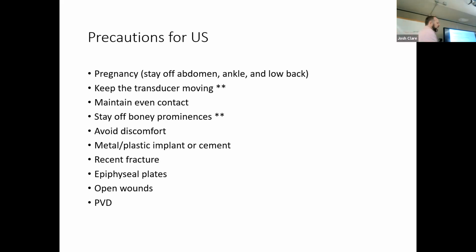So we want to maintain even contact. We always want to be moving, but you don't want to be moving like this, where you're getting the ultrasound head off of the patient. You always want to have firm contact with that patient. Stay off of bony prominences. It's going to reflect the sound energies, and the tissue in between the ultrasound head and the bony prominence is at high risk for that unstable cavitation because the sound energy is bouncing off of the bone.